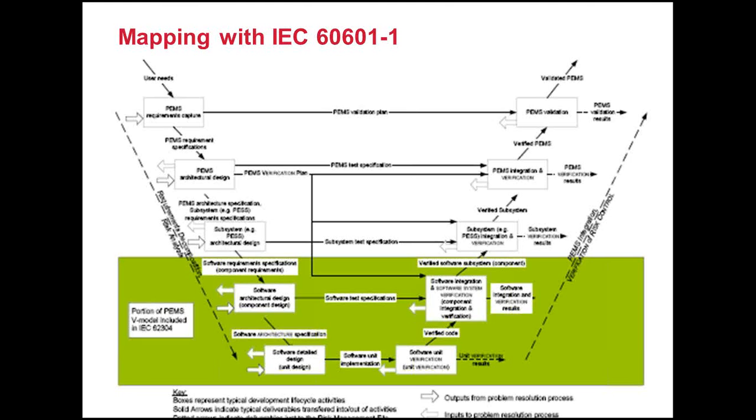In this standard, there is one particular section which talks about the software. Again, these requirements are based on the risk classification of the software. Once you classify the software, what requirements from 62304 are to be complied with is defined in the standard itself. And this standard also gives guidance of a methodology which you can adopt.